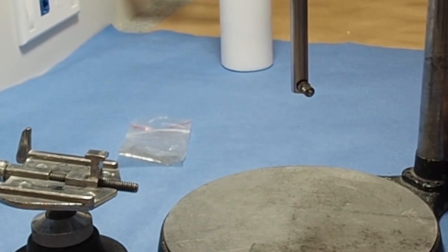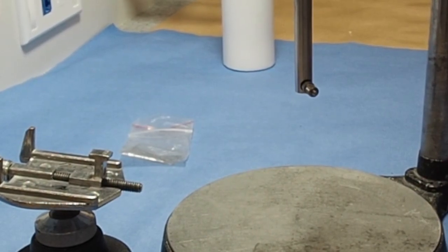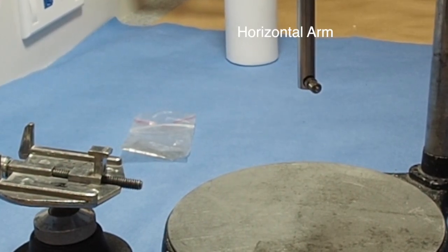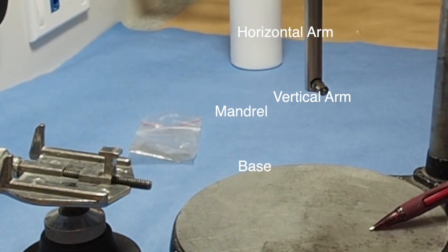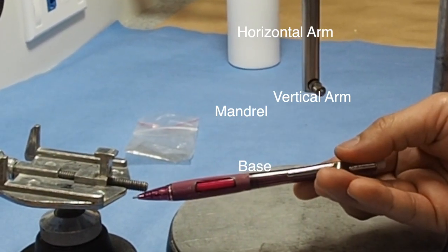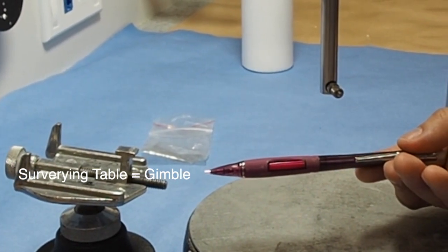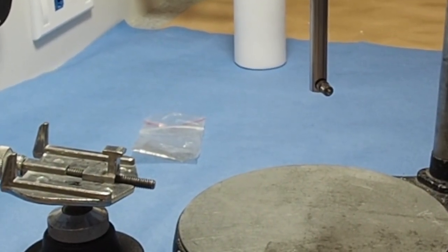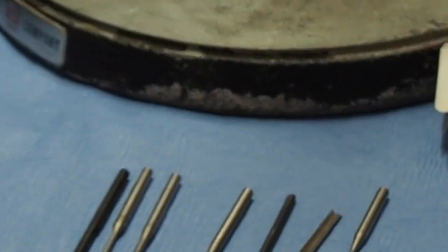First off, here's our surveyor that you're going to be using here. In the lecture you had described the sections of the surveyor where you have the horizontal arm, the vertical arm, the mandrel, the base, and we have our surveying table, which you'll hear some of us old timers call a gimbal, but I think most of those people are gone. And then in front of it we have the instruments.